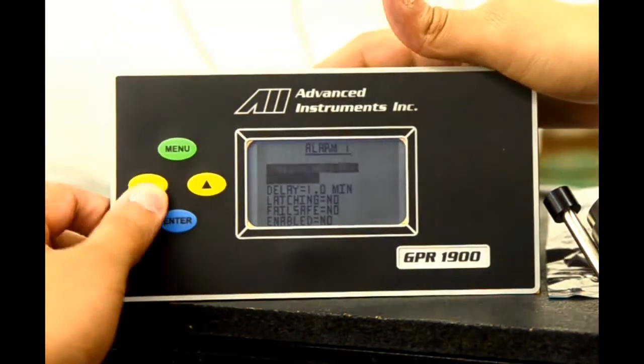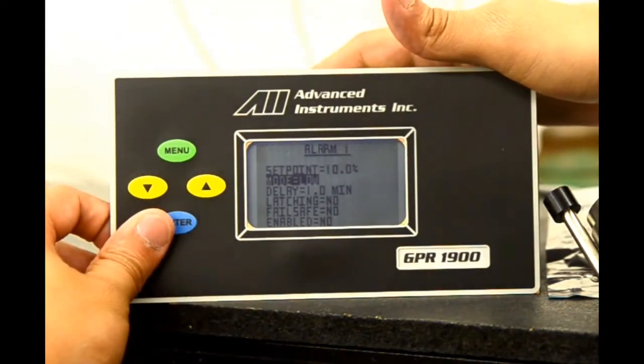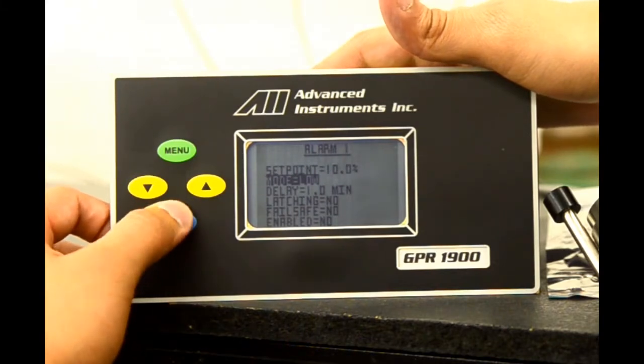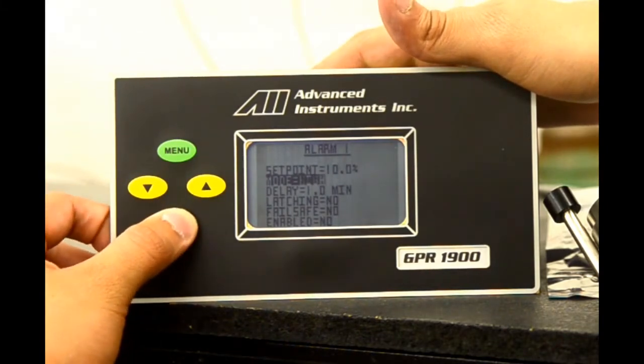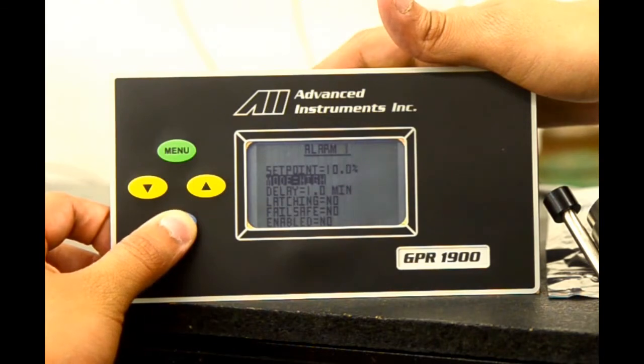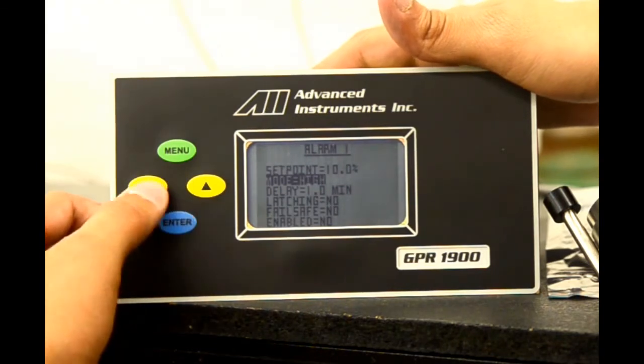Currently, the mode is low. This means that if the oxygen is below 10%, the alarm will fire. We select enter to set it as a high alarm. This means that if the gas is above 10% oxygen, the alarm will be enabled.